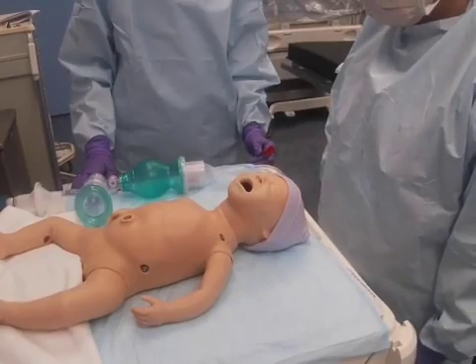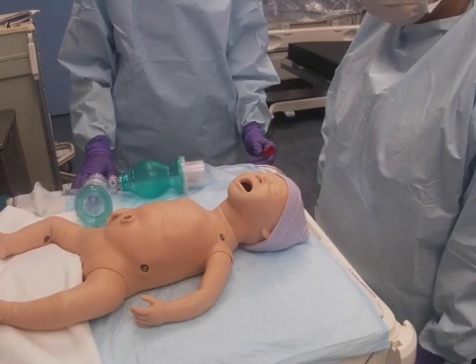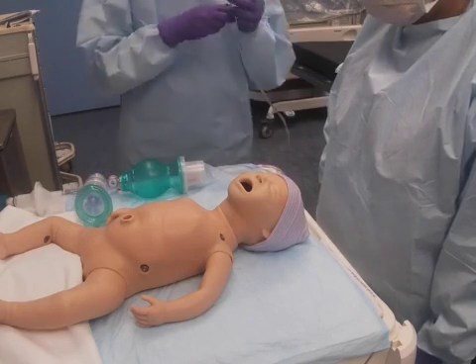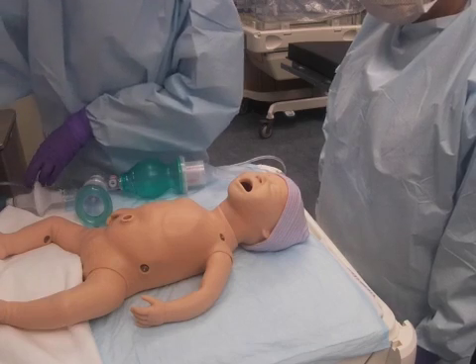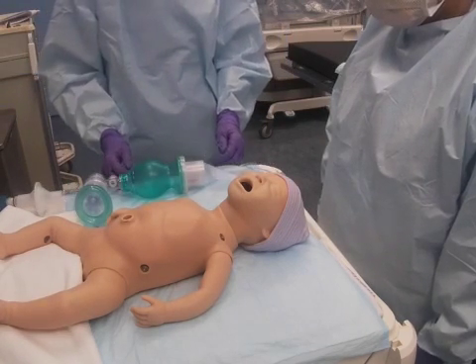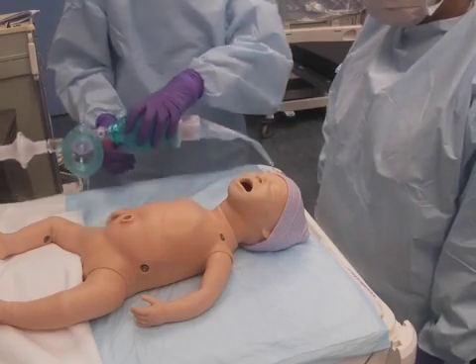Providing positive pressure ventilation: the NICU resuscitation team must don proper PPE per institutional guidelines. First, connect the oxygen tubing to the oxygen supply and set the oxygen flow to 10 liters per minute. Use the preassembled bag mask filter valve device to provide positive pressure.